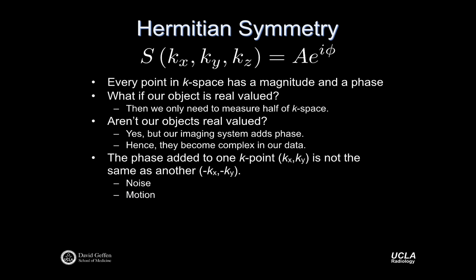In fact, it can happen because of motion. So if we saw artifacts as a consequence of motion previously, those same sources of motion can add phase to the signal. And since the motion has this funny correspondence to when you're acquiring your k-space, the amount of phase added to a k point can be different depending on the underlying motion pattern. You can have things like resonance frequency offsets that occur during the acquisition, so-called hardware group delays, meaning that you're acquiring data at the beginning of k-space, but there can be delays in this acquisition system, even at the scale of microseconds or less, that will cause small discordances in your acquired data.